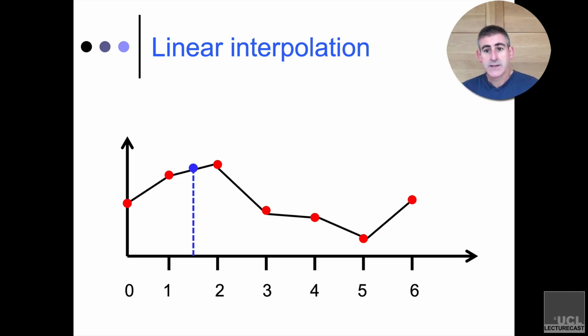But if I'm moving 7/10 of a step in one direction, then it's not add them together and divide by 2. You actually have to weight it by how far you've moved. But that's what a linear interpolation does. It allows you to say, well, if I just draw a dot at the point where I wish I had collected the data, what would the value there be? And I'm going to replace it with that value. That is a quick and dirty version of linear interpolation.